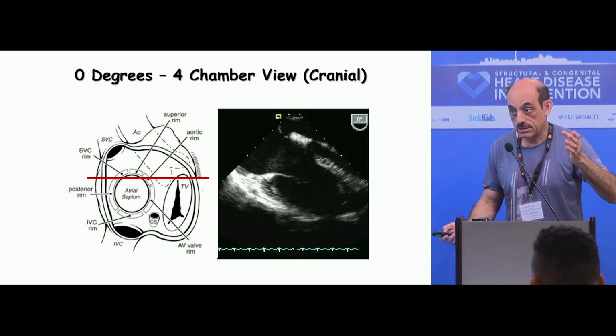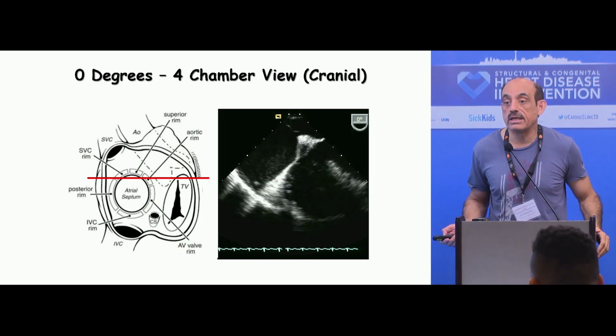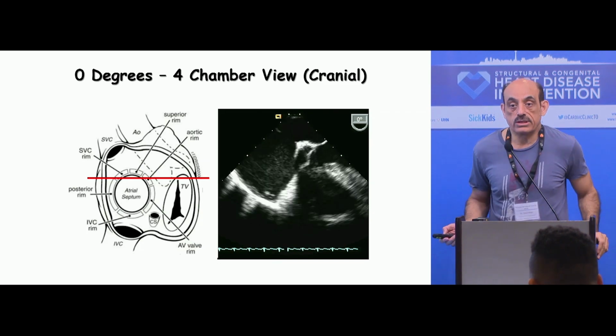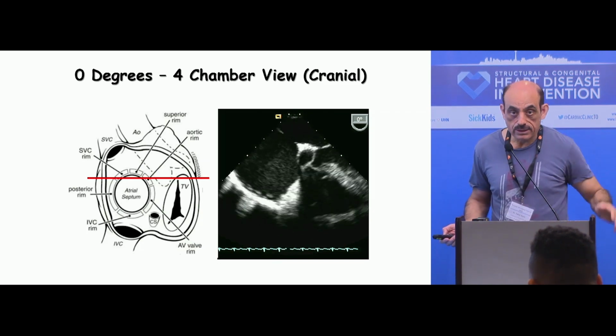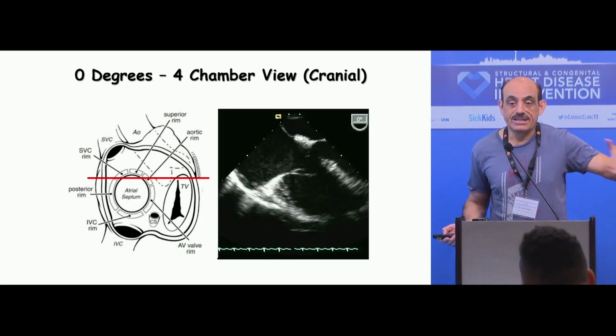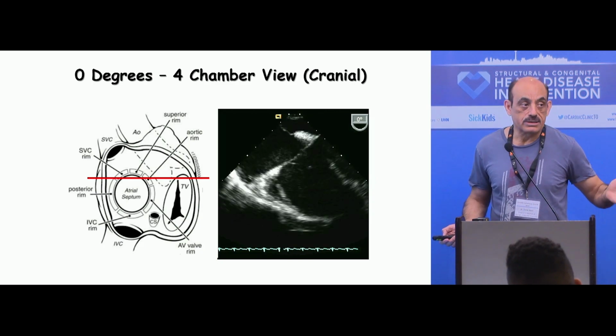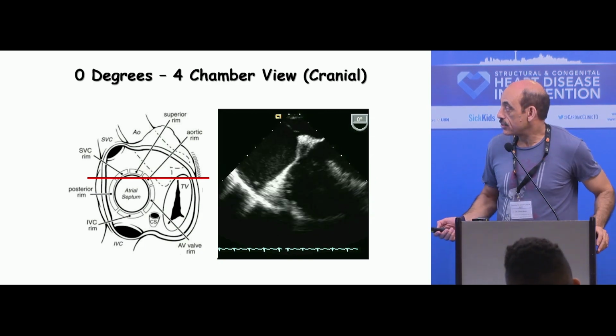Does that make sense? So this is why sometimes when you put a device and you say the device was 3-4 millimeters away, and yet the patient had mitral valve perforation. You read the literature, there are at least 10 cases described. If you look at it, it's because they did not really look at the whole span. It's not going to come to bite you all the time, but once in a while it can bite you.